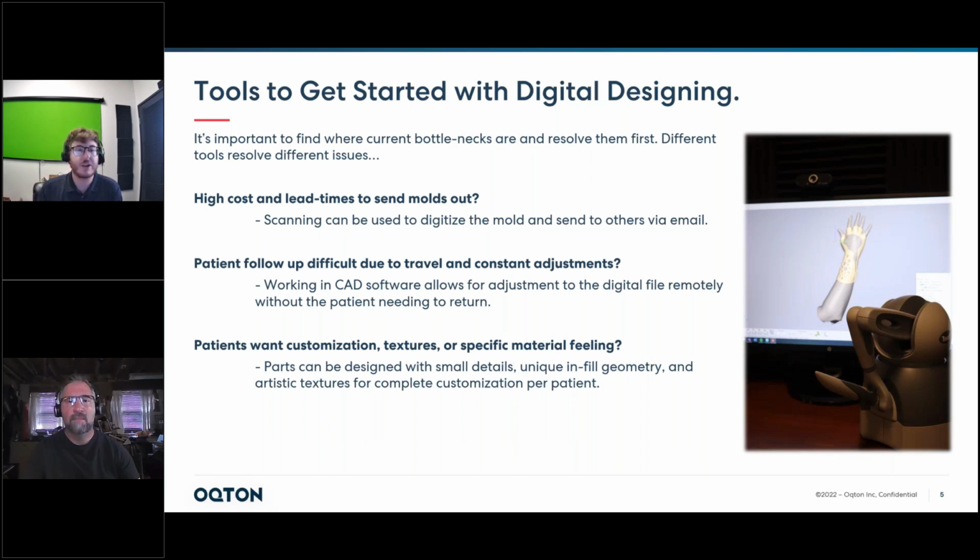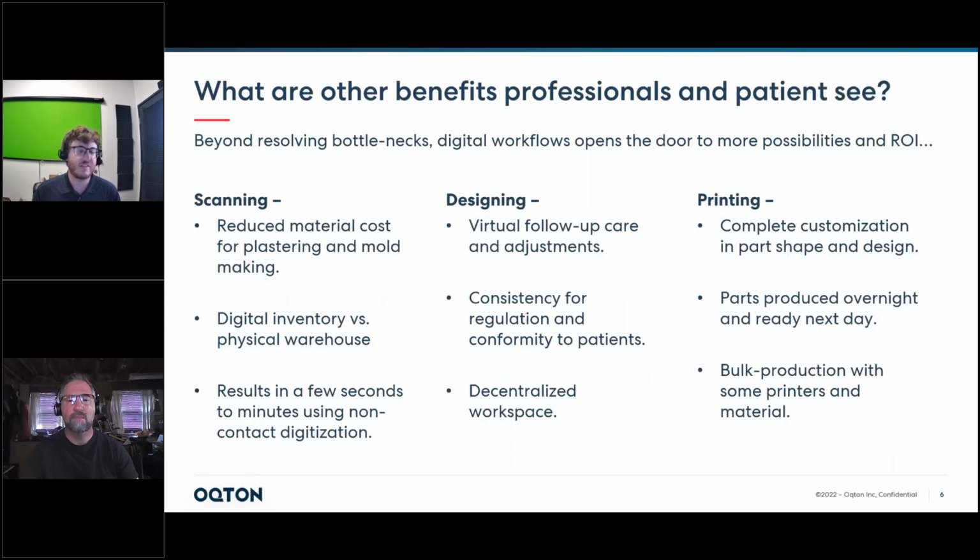And then finally, when it comes to customizations and these textures with 3D printing, this opens up new realms of what you can actually assist with, creating more customized parts for your patients so they feel more comfortable using them. So as you can see, these are specific areas in which we commonly see people ask about digital workflows for their needs, but there are other benefits and ROI that can come out of it as well.